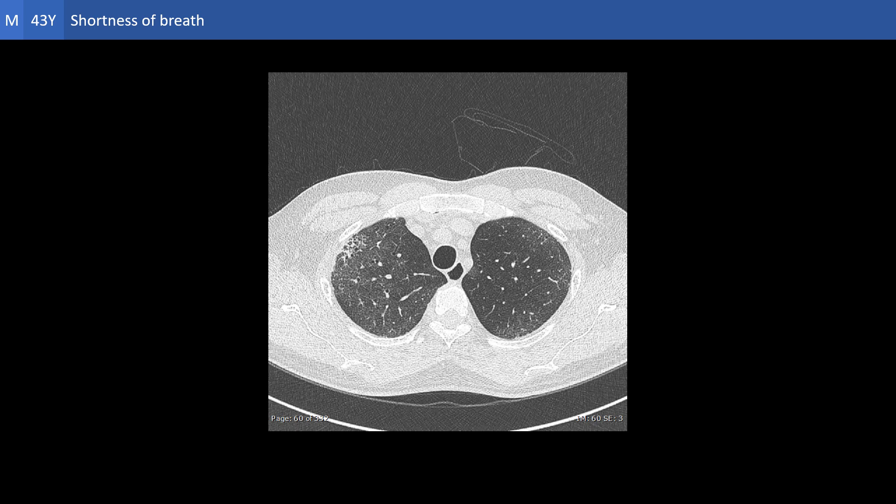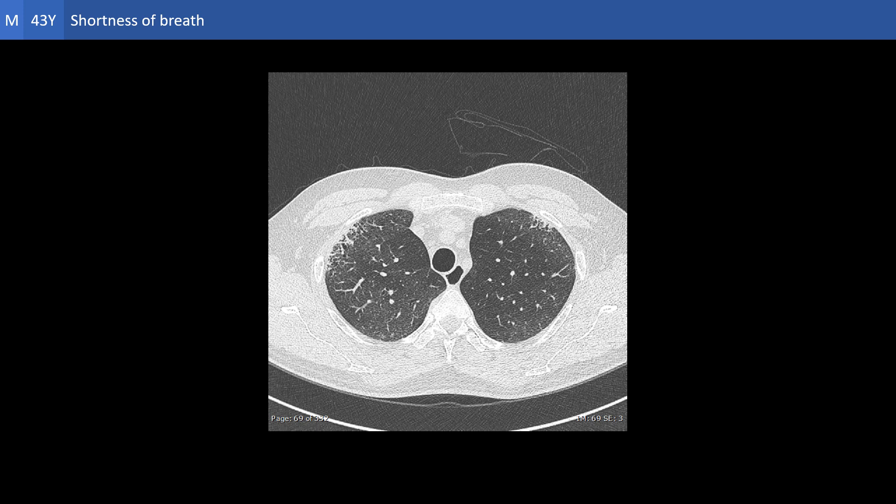CT of the chest shows four patterns of lung involvement, more or less mixed together: reticular pattern, ground glassing, honeycombing, and bronchiectasis.